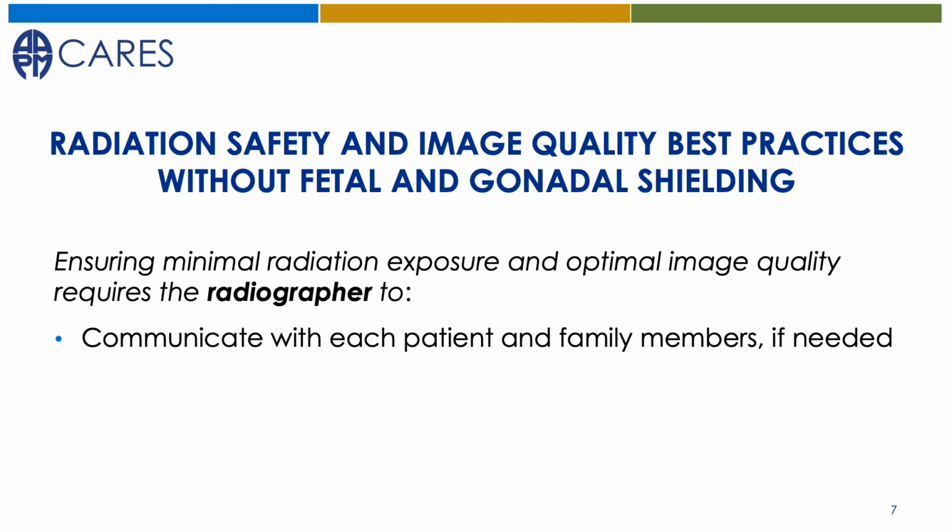Radiographers must employ excellent communication and listening skills with each patient. In instances when the patient is unable to communicate, it may be necessary to converse with a family member or caregiver. Explain the procedure to the patient prior to beginning the procedure and let them know what to expect during the procedure.